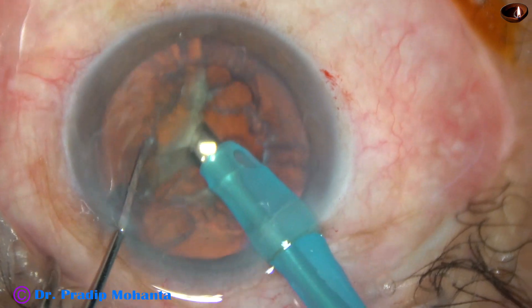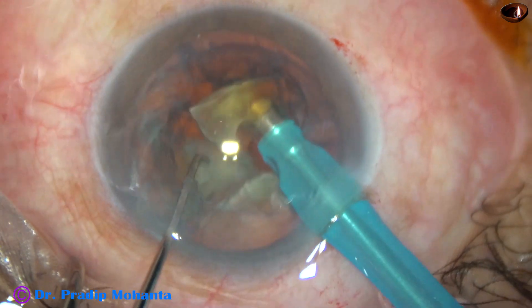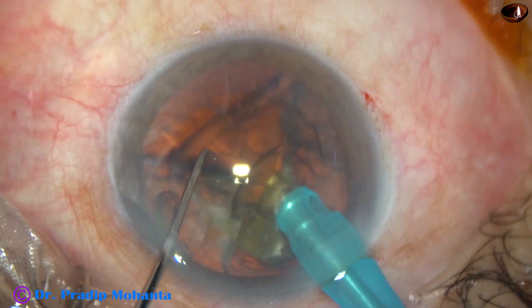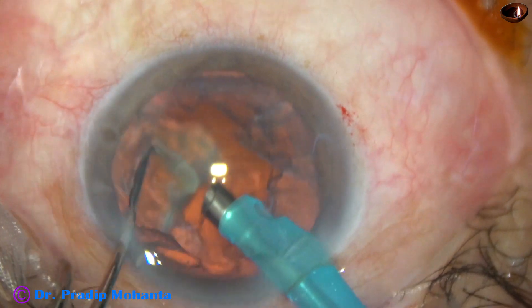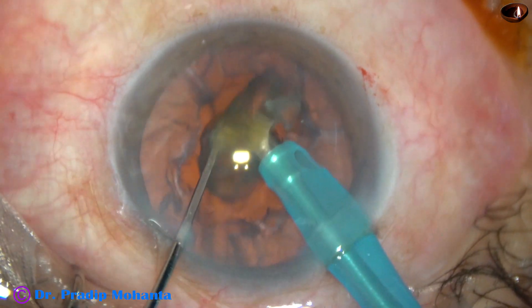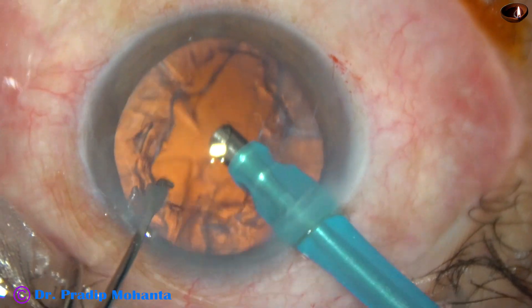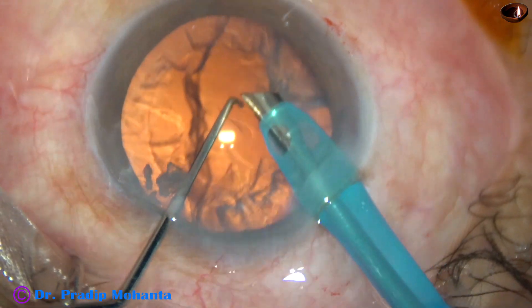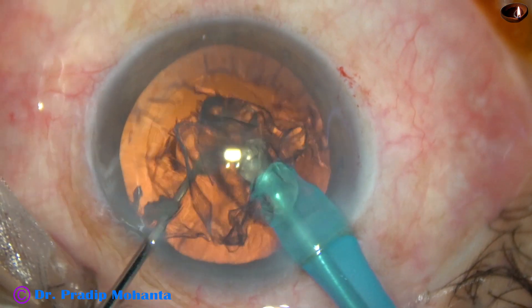This is the third nucleus fragment; it is also divided into two pieces. The FACO ultrasonic power used in this case is 65%. Flow rate is 45 ml per minute and vacuum is 450 mmHg. In this case, I didn't decrease the vacuum for emulsifying the last nuclear piece because there was an epinuclear sheet covering the posterior capsule.